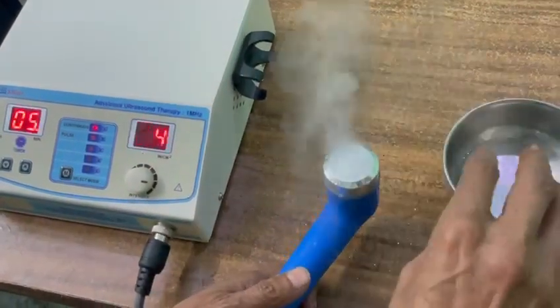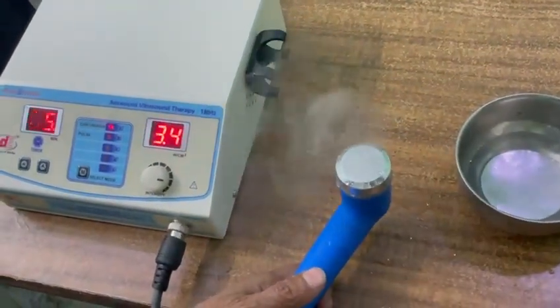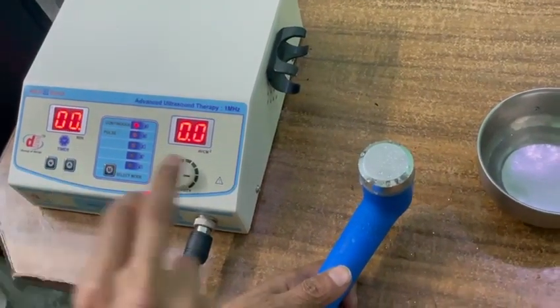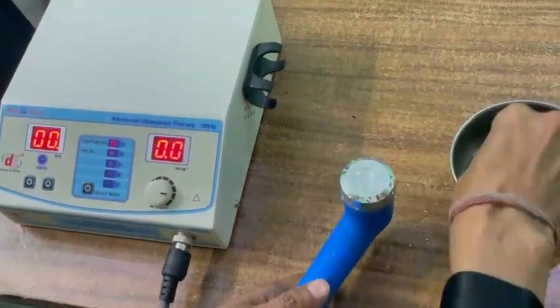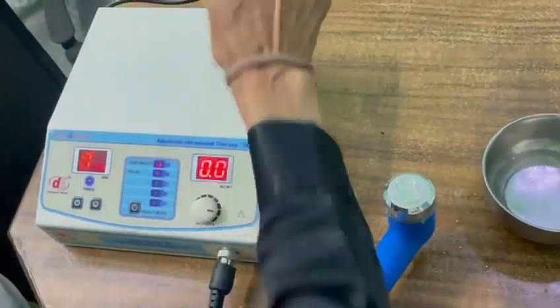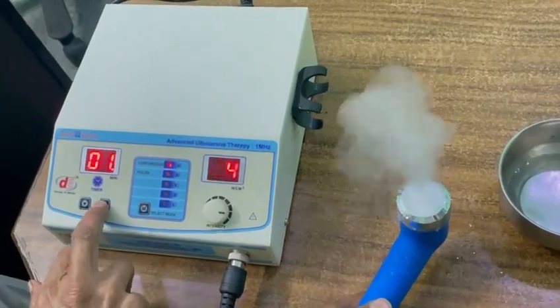Now, if you want to change the mode, stop the machine. Now it has stopped. Switch off. Now set the time again.